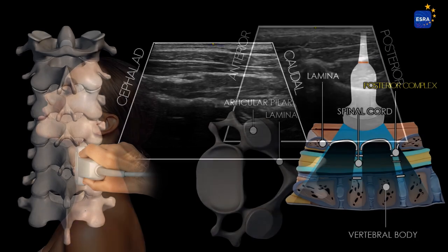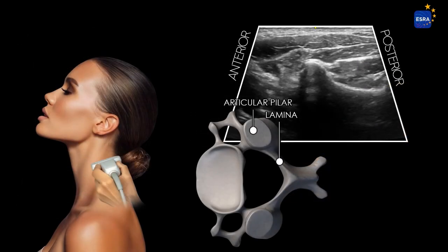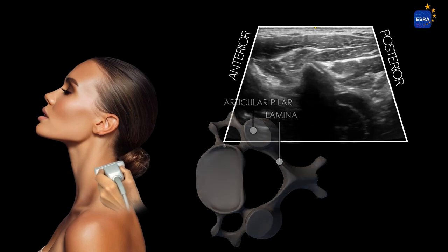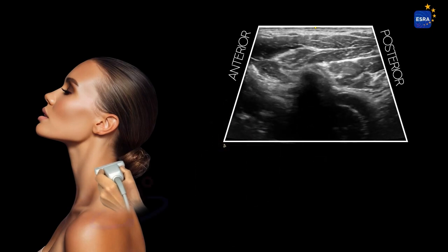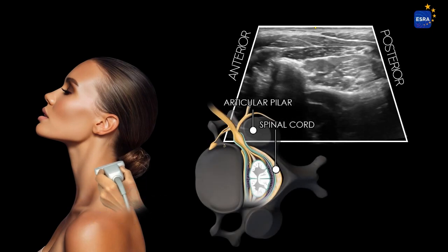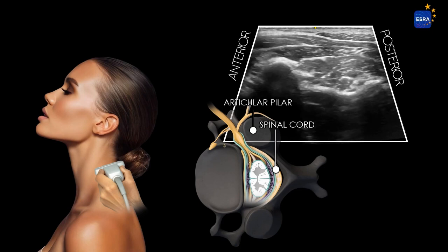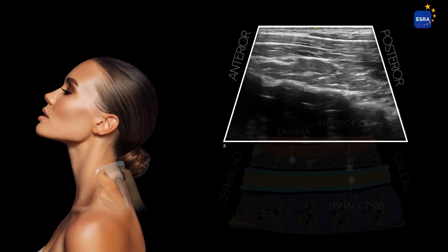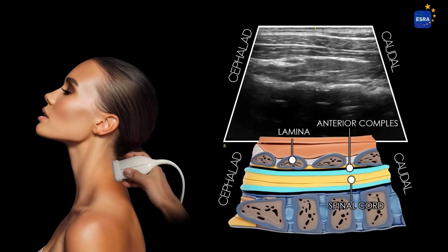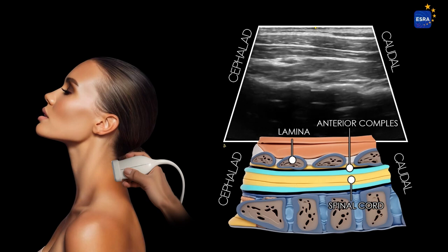Here we can observe the real-time exploration dynamics. Once the articular pillar, lamina, and spinous process are identified in the axial plane, we will slide the transducer caudally to visualize the interlaminar space and the spinal cord. At this point, we will rotate the transducer to an oblique paramedian sagittal axis where we can observe the posterior and anterior complexes between each lamina.